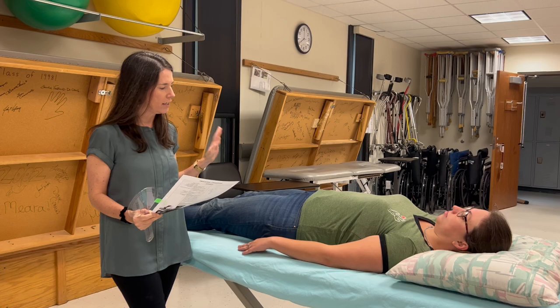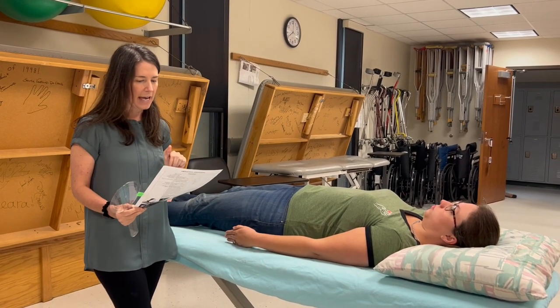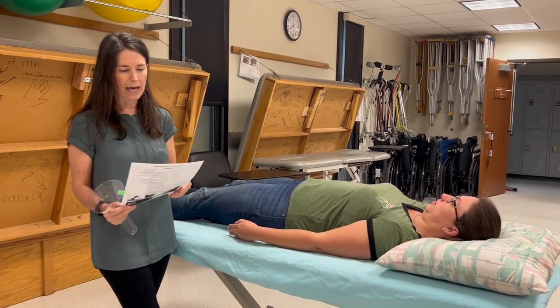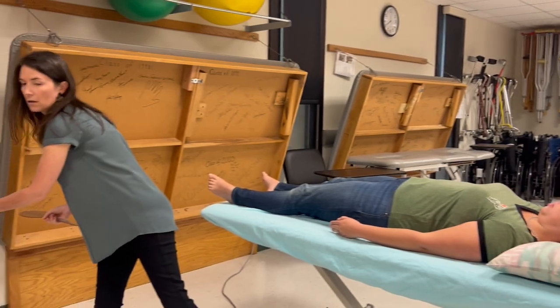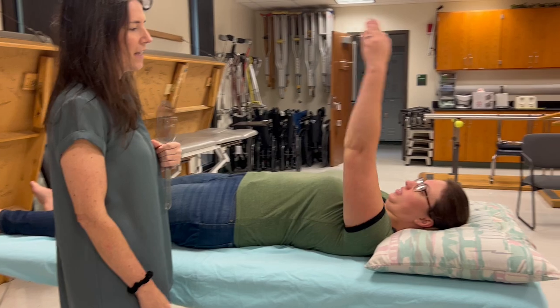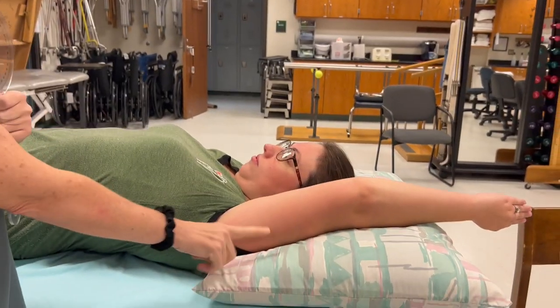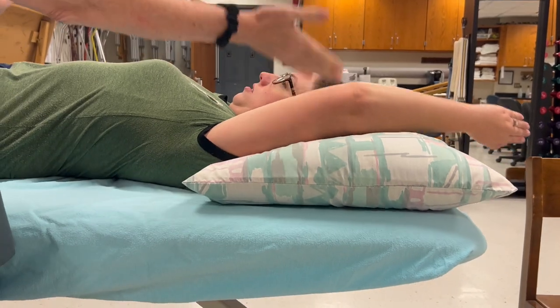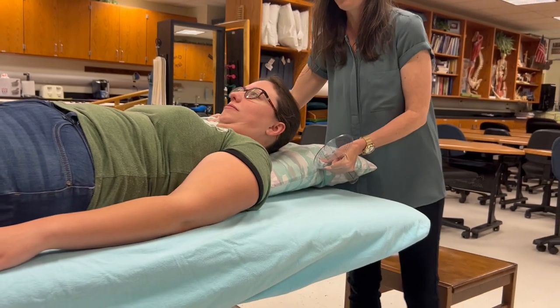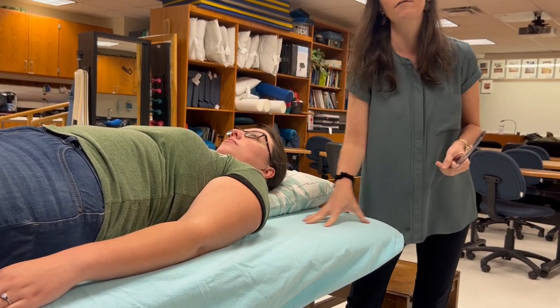The patient position is supine with the palm facing the body. I'm going to measure her left shoulder so I'm standing on the left side and I'll say bring your arm up overhead as far as it'll go. Notice that the pillow is impeding her range of motion. So before you begin, move the pillow out to the side so it's still supporting her head but not in the way of her shoulder motion.